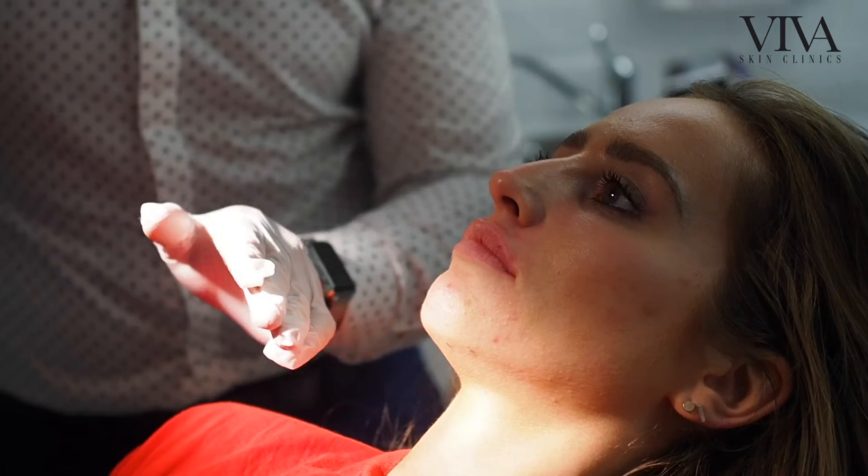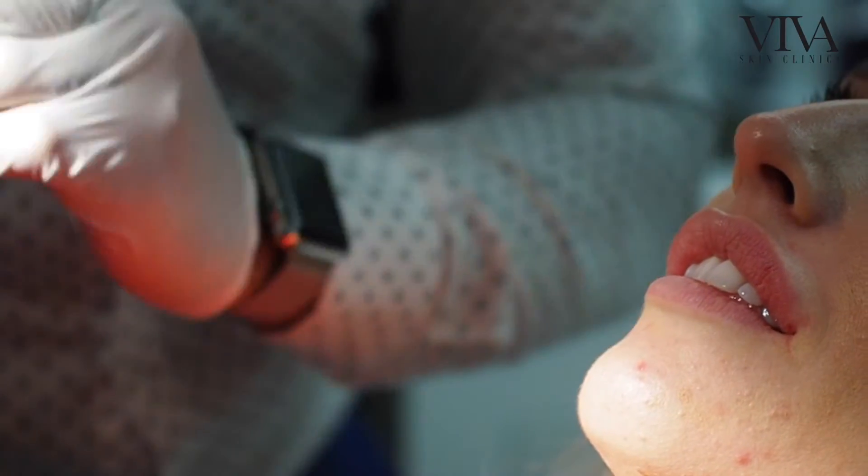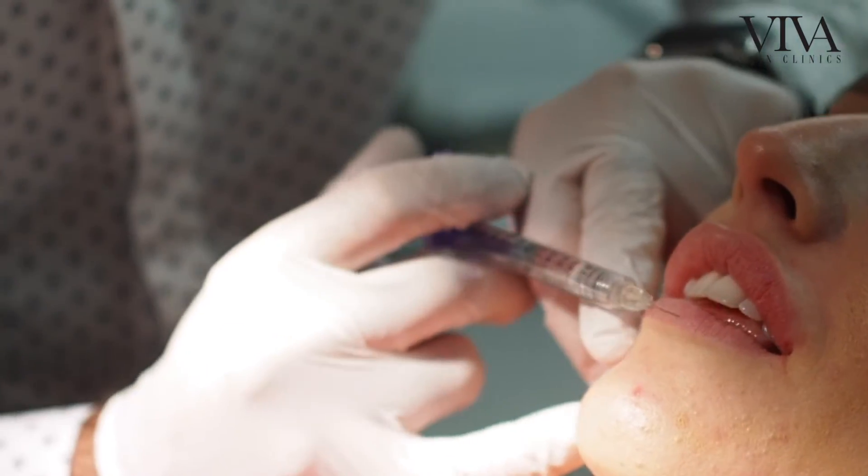So we're going to do that balancing injection in the bottom lip. We want to keep the bottom lip about two thirds of the size of the top lip, so we're going to do that.